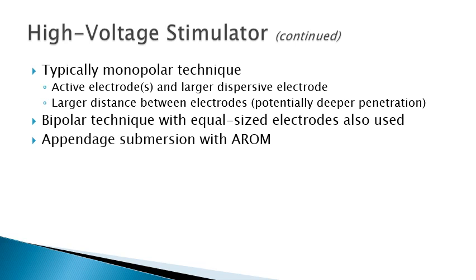If you're using it for edema reduction, the classic formula for edema reduction is to start with a negative charge. So what you'd essentially do with the monopolar treatment for edema is start with a negative charge, 100 pulses per second, so pretty high frequency, and then over time you would eventually switch over to a positive charge.